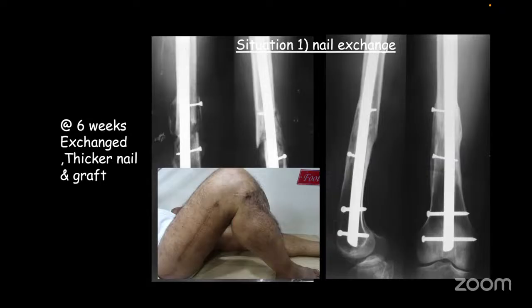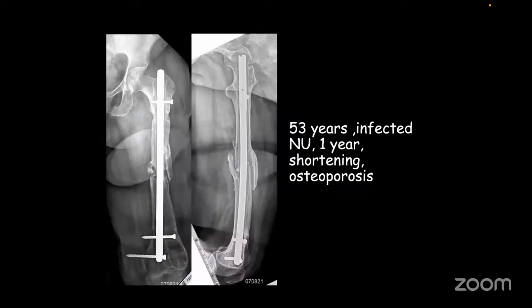So situation 1, where the infection was controlled, and now at 6 weeks we removed the nail, and then it was exchanged to a thicker nail, which had good stability, along with bone graft. Here is a case, 53-year-old, infected non-union, 1 year, had shortening, osteoporosis, and loosening.